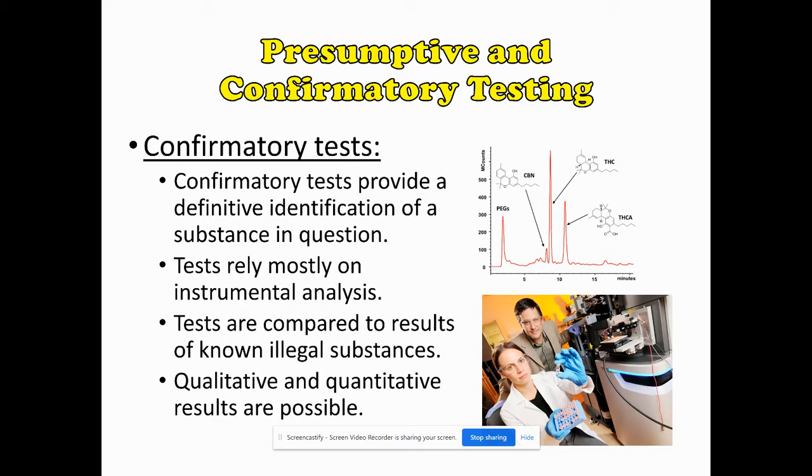Confirmatory tests provide a definitive identification of the substance in question. So, is this a substance? It is absolutely 100%, beyond a shadow of a doubt. We thought it was, and it actually is. You're not going to fool this test. They're expensive. They usually use expensive equipment and require highly specialized training to do so.